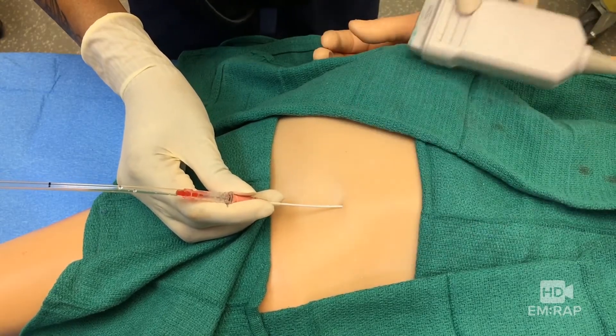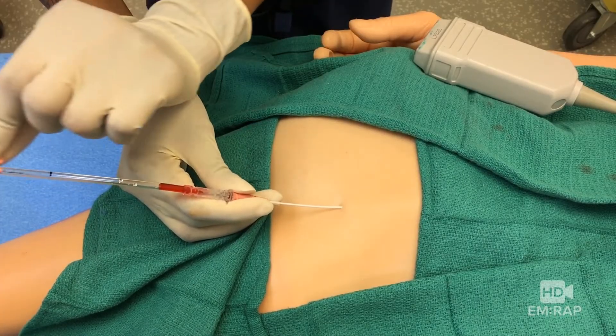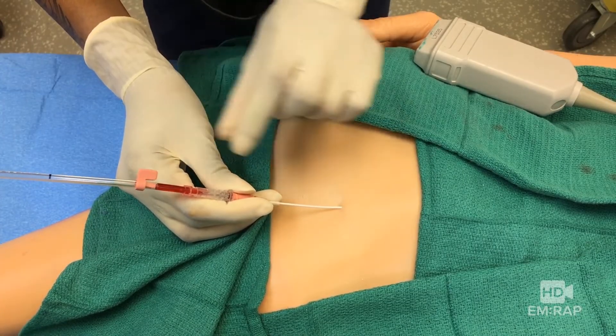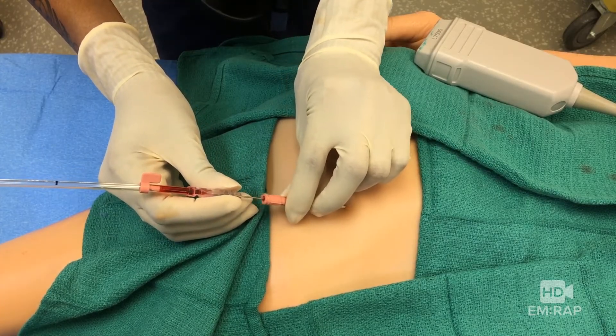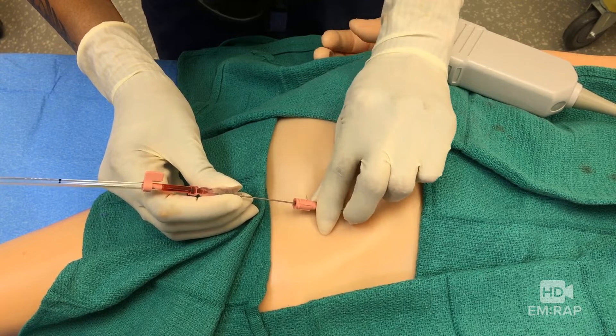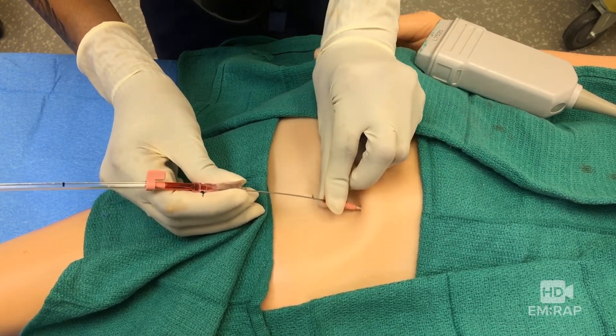Make sure that the blood is filling up the catheter. Now you can advance the guide wire as long as there's no resistance. And if there is, maybe you backwalled it — try backing out just a little bit and see if that works, otherwise you have to start over. Once the guide wire advances easily, you can slide the catheter over the guide wire, and this should be as smooth as silk.